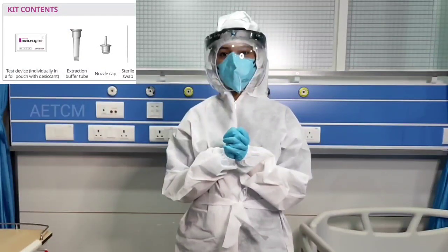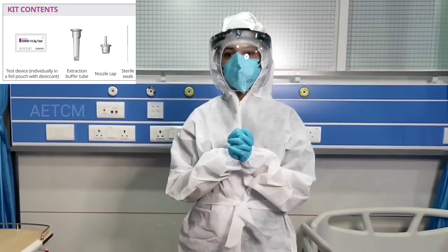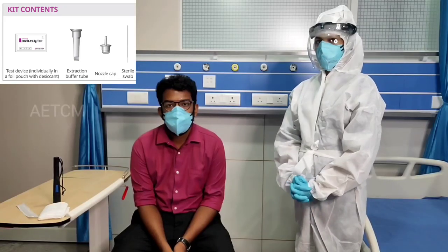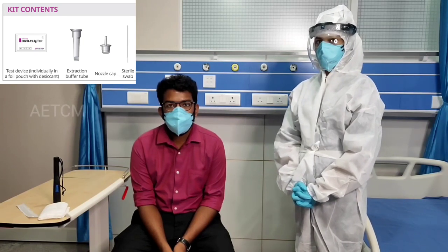The person who is taking the swab should be wearing adequate recommended personal protection equipment: an N95 mask, goggles or a face shield, and gloves and a coverall.